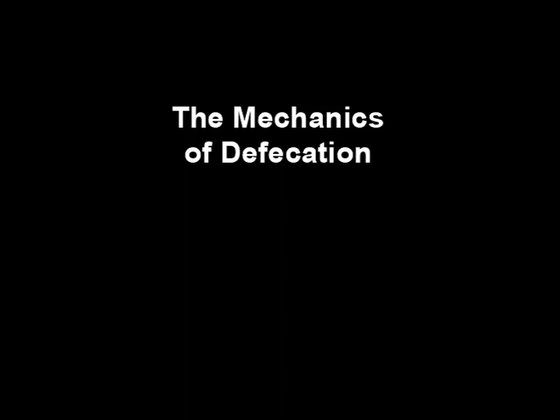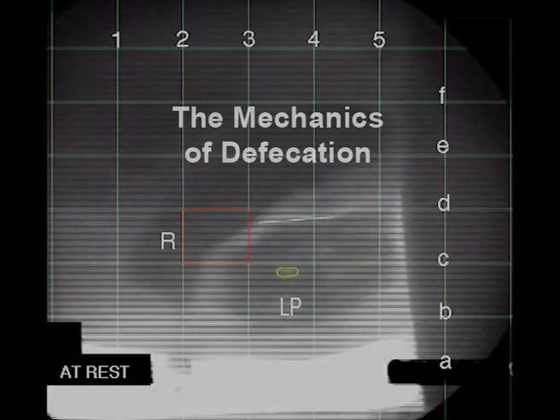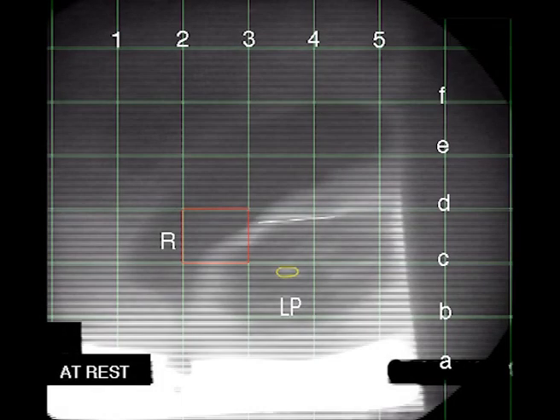What will follow is a defecating proctogram. The purpose of this still X-ray is to identify the different anatomical structures which you will be seeing in the video sequence. R is the rectum. It has had radio-opaque dye injected into it. The red square identifies the anorectal angle.